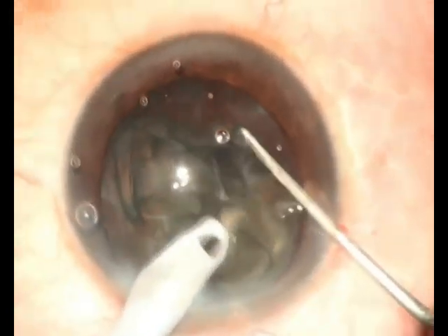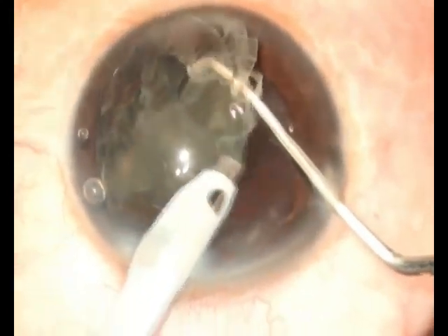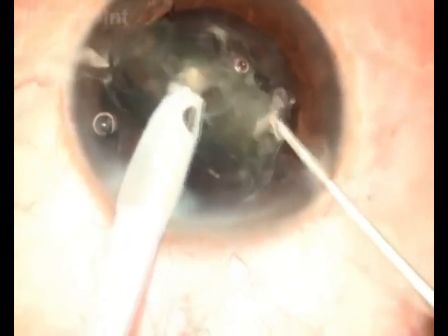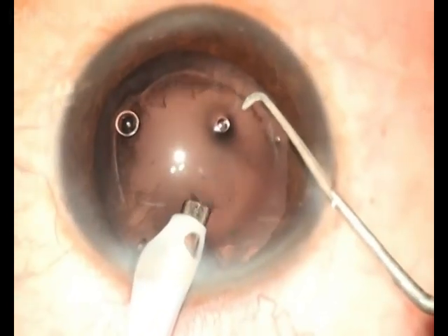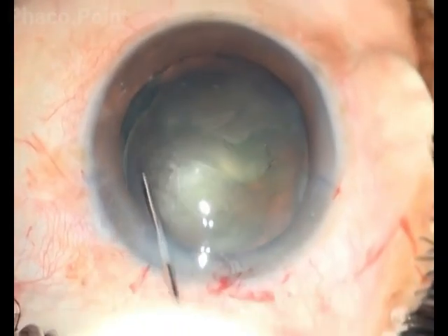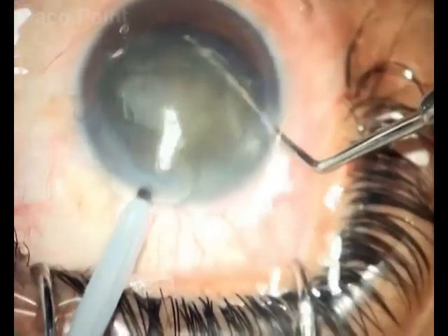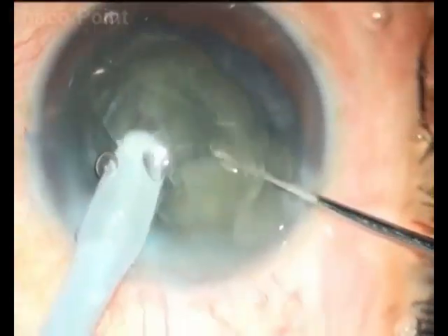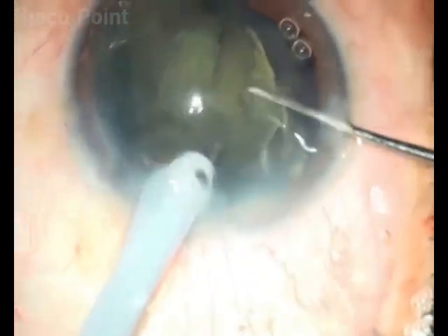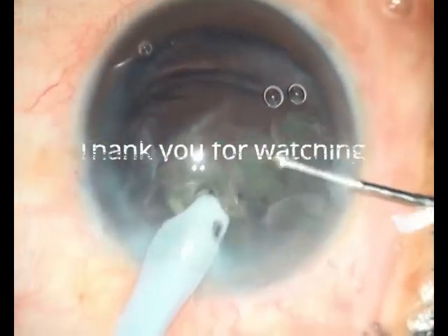You do not need to be concerned about excessive energy being delivered so close to the endothelium. Equally importantly, dealing with these nuclei out of the capsular bag reduces the danger that could occur to the posterior capsule whilst emulsifying these soft cataracts. Finally, if you're dealing with a soft cataract that has a very early nuclear sclerosis, it's still well worth it to do a hydroprolapse, hold the nucleus in the elevated position, and in that stilted-up position perform a direct chop. Remember, the energy delivered here is marginal — energy is only required to impale the nucleus before chopping, as well as an occasional burst during nuclear emulsification.